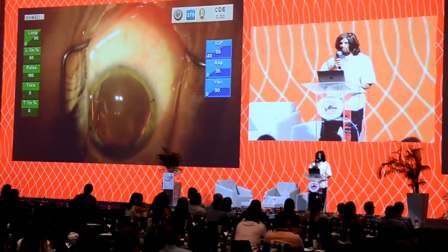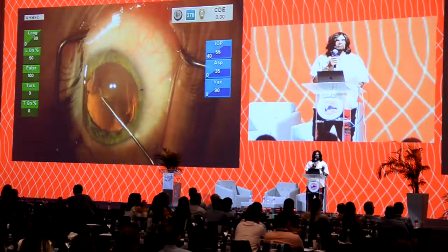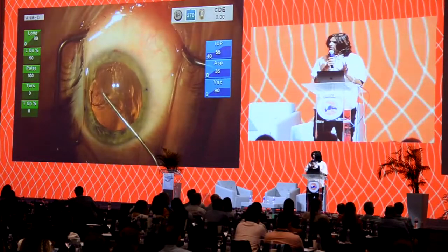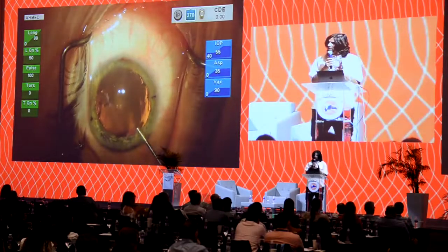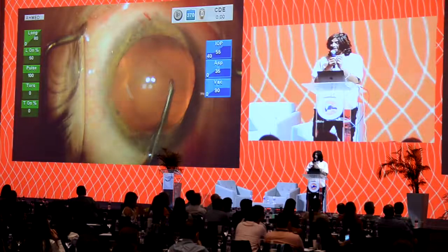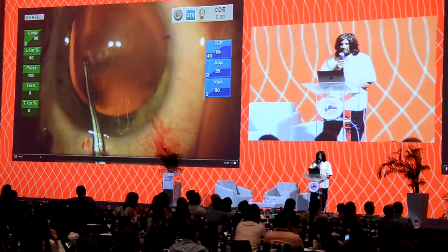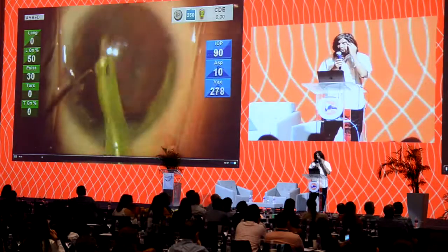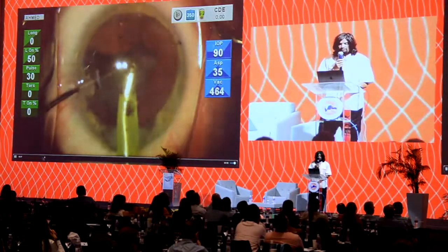She loved her multifocal contacts. And I'm not a big, eager multifocal IOL surgeon, I'll be honest with you, but she convinced me to say, hey, listen, I really want a multifocal lens. I was worried, of course, because I'm going to suture her pupil down. I'm worried, of course, if she's unhappy, I'm going to have to undo all my work. But the good news is she won't have a large pupil, which can impact at least some multifocal lenses.